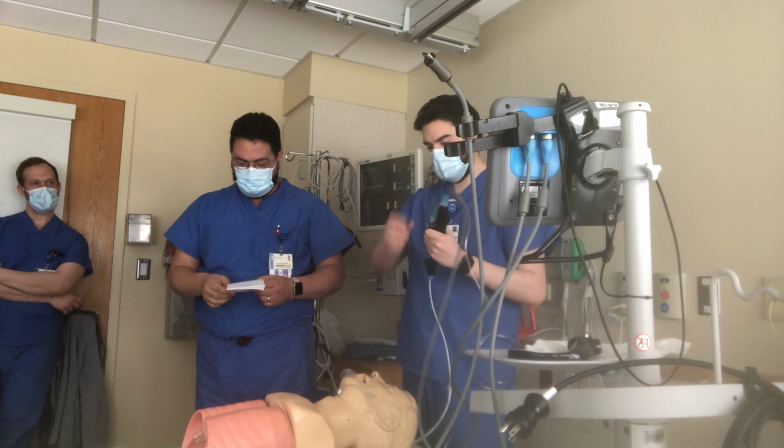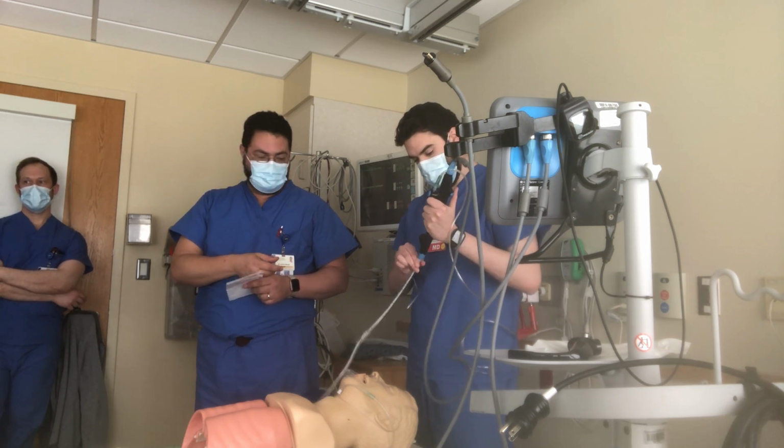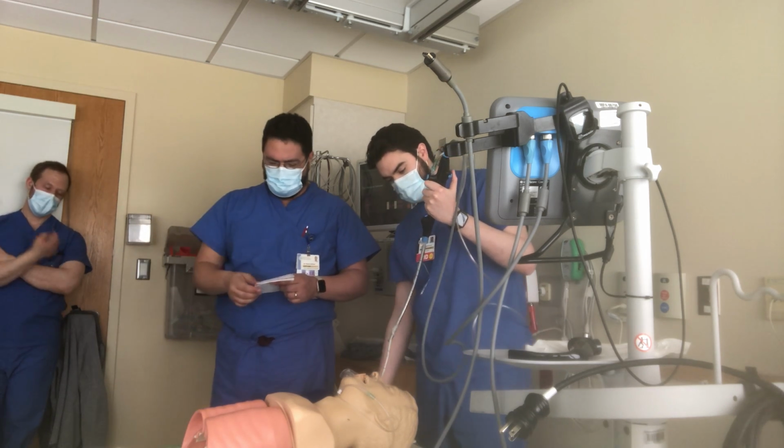Right, now, next, as you're preparing. Question, is there a smaller ET tube? No, we usually have smaller ones. This is an 8. I was gonna say that's not gonna go in his nose. I didn't have good lubrication.